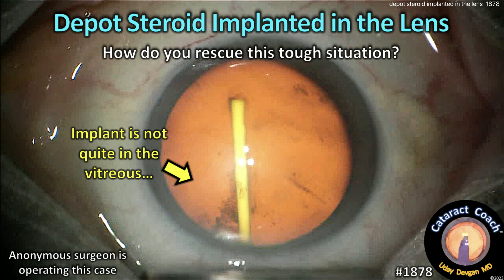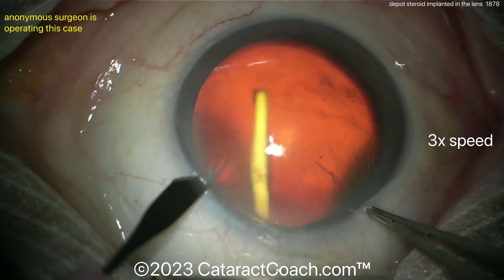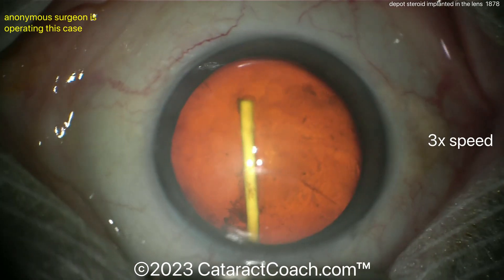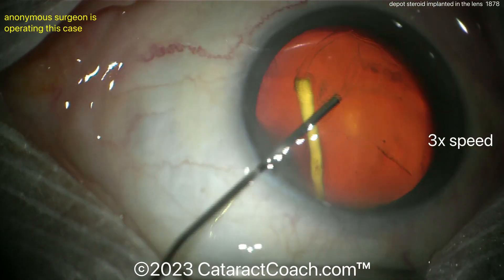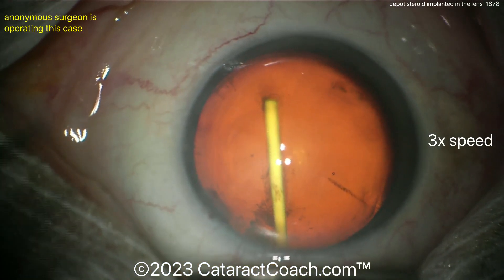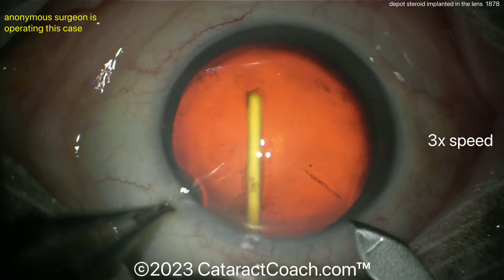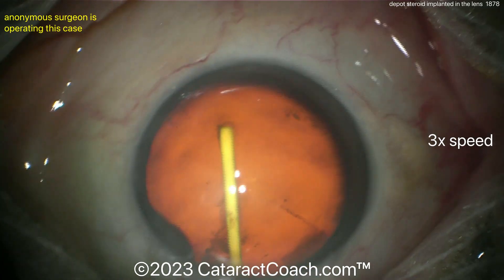A depot steroid implanted in the lens — wait, that's not quite in the vitreous cavity like intended. This is a tough case: a patient was receiving an intravitreal long-acting depot steroid implant, sold under various names around the world, which was supposed to go in the vitreous cavity but ended up inside the crystalline lens. So obviously the patient is going to need cataract surgery.